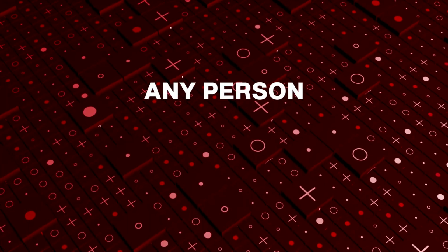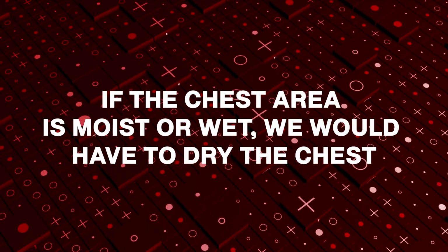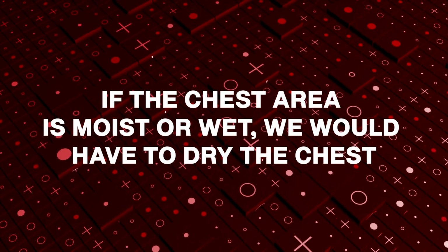So again, AED machines can be used on any person of any age under any condition, with the exception of a couple things. Number one, if the person's chest area where the pads go or between the pads is moist or wet, we would have to dry the chest because obviously water particles can throw off the analysis of the device as well as its electrical shock.